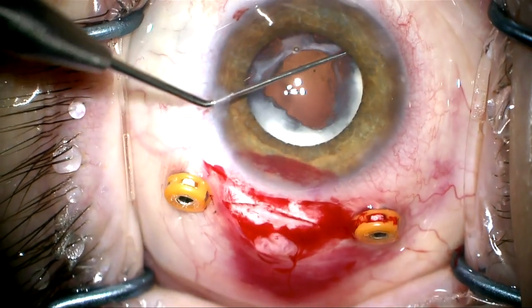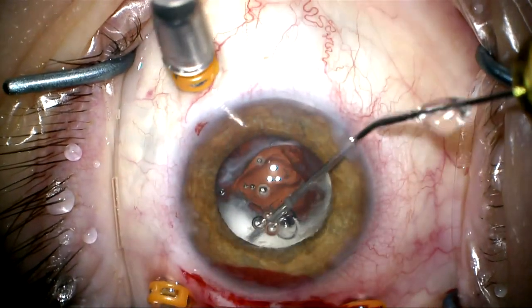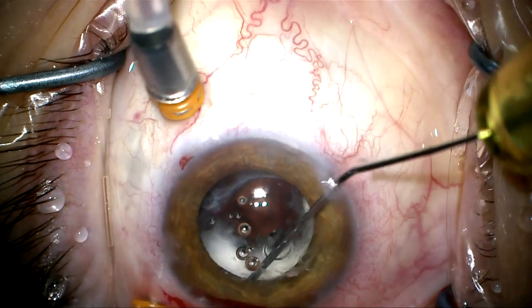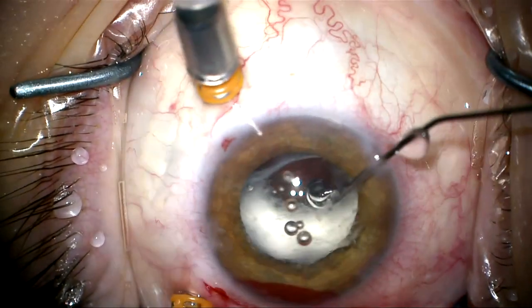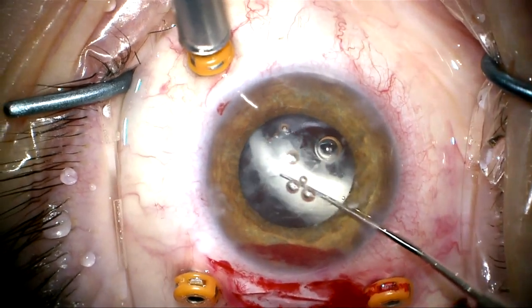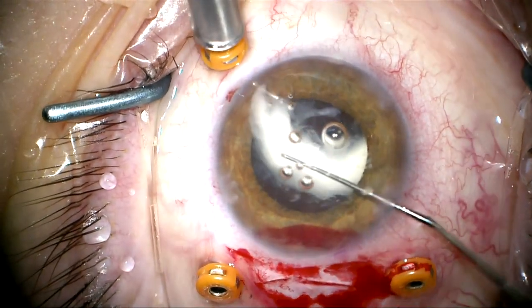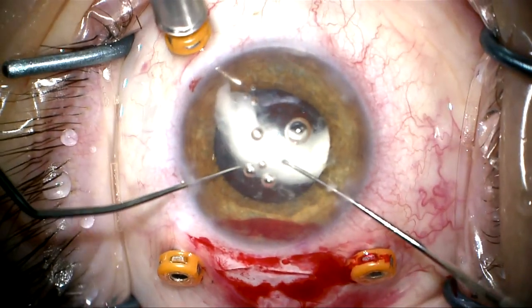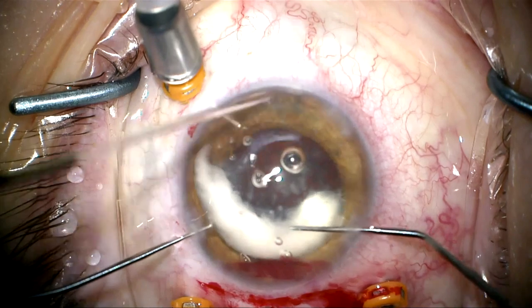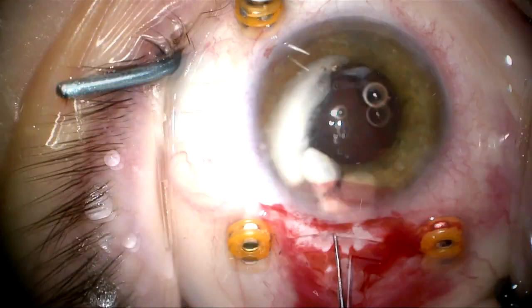You can see it's starting to loosen up. I still feel some resistance so I'm going to switch to dispersive viscoelastic and try to visco-dissect any adhesions to completely free this up. This is a pretty big Soemmering's ring segment. I feel it coming out of the capsular bag and I want to make sure it doesn't drop into the back of the eye. I'm going to manipulate it forward and introduce a reverse Sinski hook underneath it to support it as I dial it up into the anterior chamber. I'm now going to cut this into a smaller piece so I can remove it.